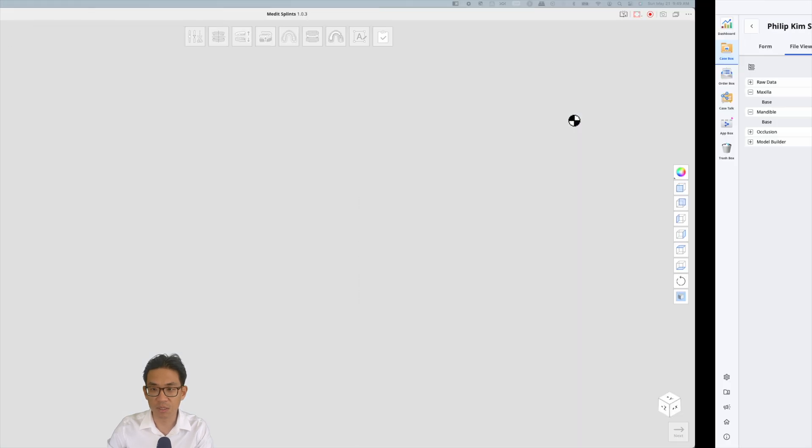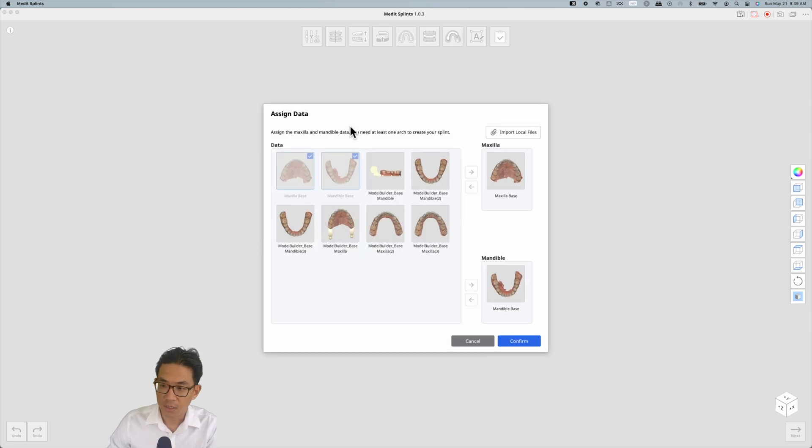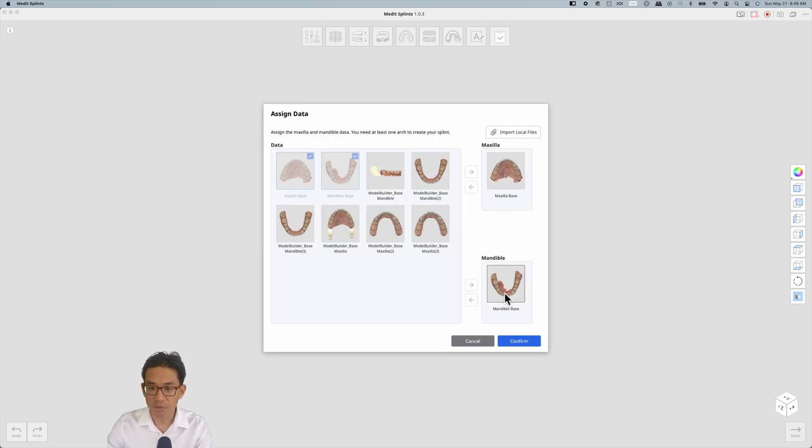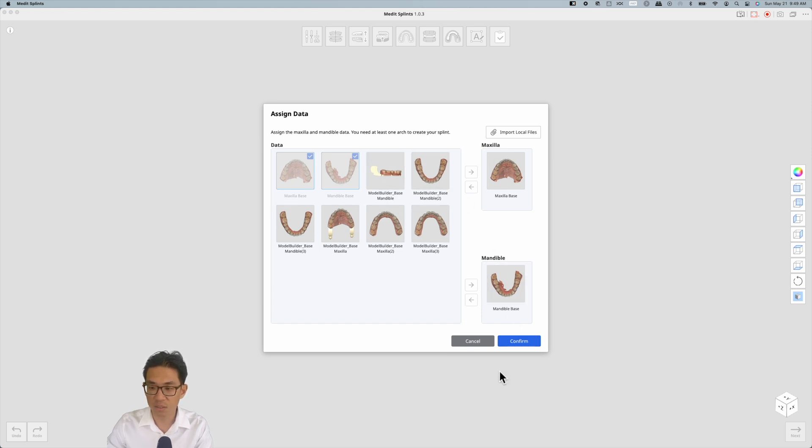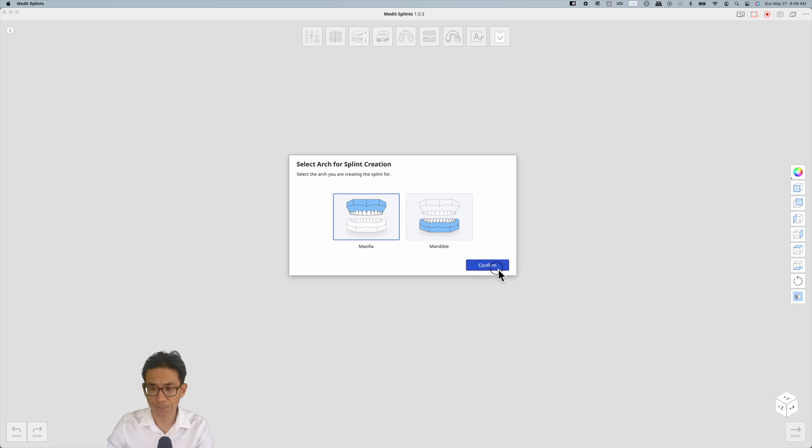Just make sure it's up to date and it automatically selects the maxilla base and the mandible base. You can use others if you'd like, but for the purposes of this, this is what we need and I hit confirm. I want to make a maxillary night guard. You obviously have the option to make the lower one as well.